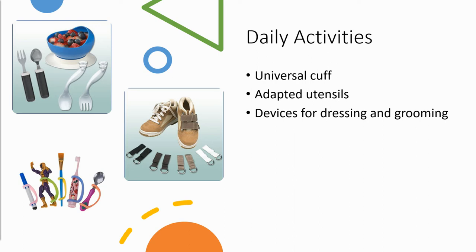So this helps them to be able to grasp different objects and to be able to manipulate them better to increase independence. So as you can see, with the marker, the child will be able to write more, paint, brush their teeth, eat. So really just increasing their independence in their self-care activities as well as leisure activities.